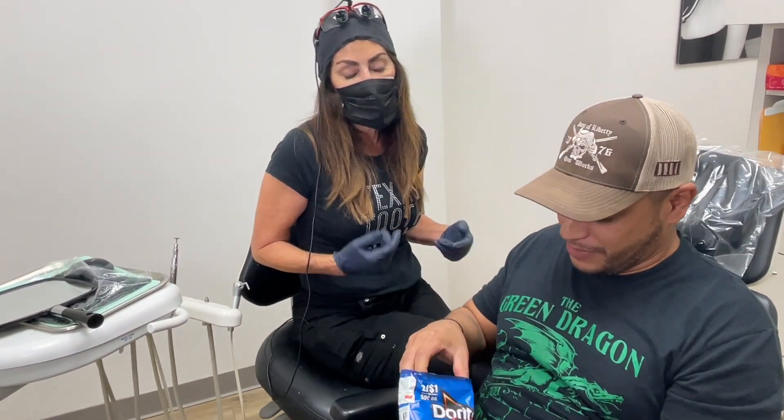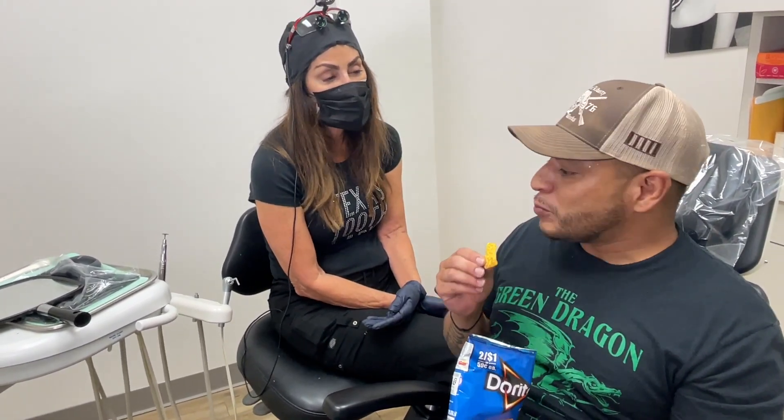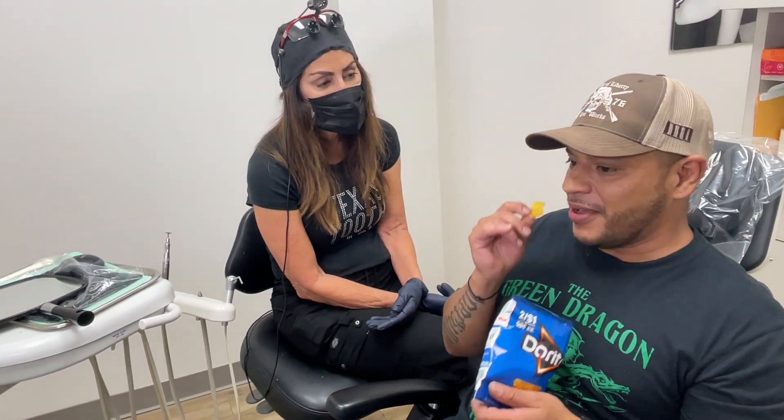Open up and go ahead and eat. We're going to show you that he can eat with them. Is it loose? No. How does it feel? It feels amazing because with the old ones, if I was to eat anything, it would get under them and I could feel it in my gums. With this I can't feel anything — it's just like normal. And can you taste your food? Yes. You can have the whole bag of chips and more.